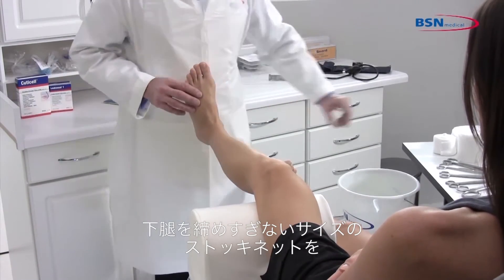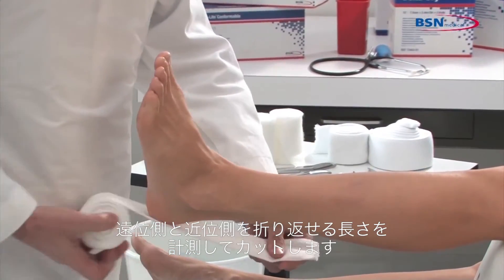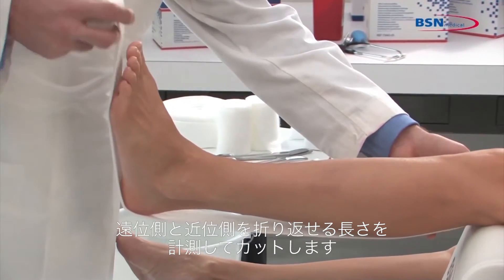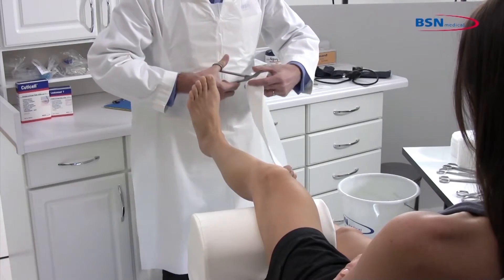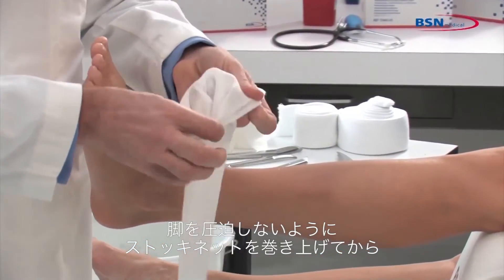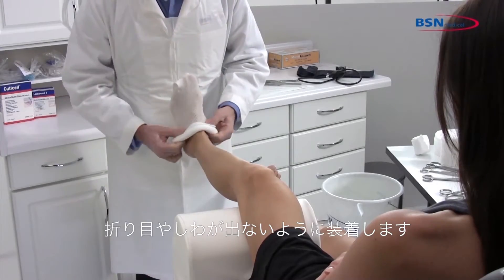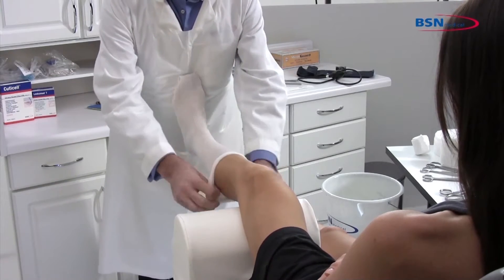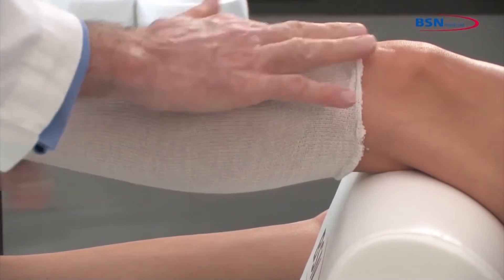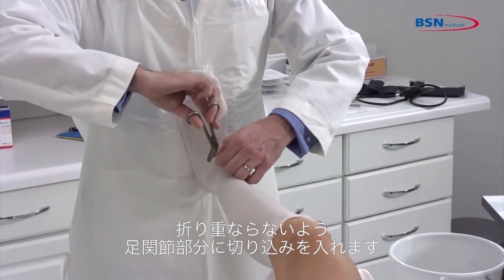Select a stockinette that will not be restrictive at the widest part of the limb. Make sure you use enough stockinette to allow foldbacks at distal and proximal ends. Roll up the stockinette before applying to the limb to lessen pressure while applying. Roll on and remove all wrinkles and creases. A small cut may be needed at the anterior ankle to prevent the stockinette from creasing.